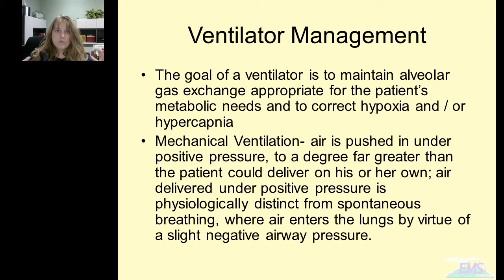Well, suddenly we went from drawing it in through negative pressure to it being forced down into their lungs, to a degree far greater than the patient could deliver on his or her own. Positive pressure is physiologically distinct from spontaneous breathing. Again, that's all about that negative pressure. So we are doing, not damage, but we're doing significant changes to the physiology in the lungs when we're forcing the air in by that mechanical ventilator.